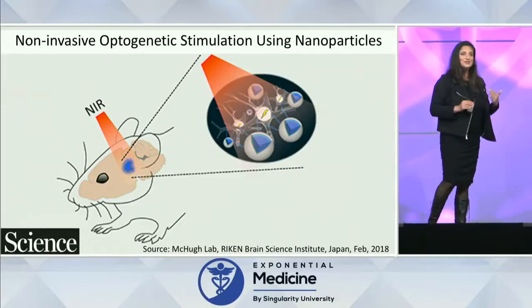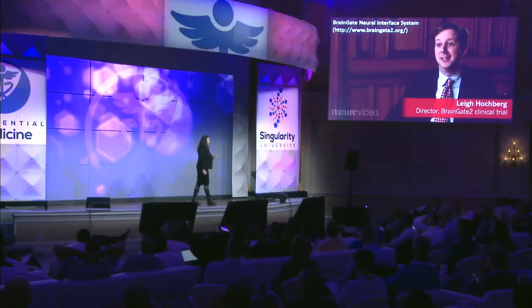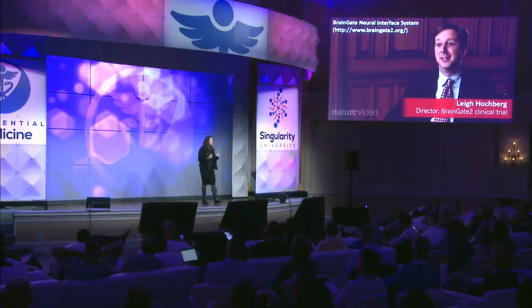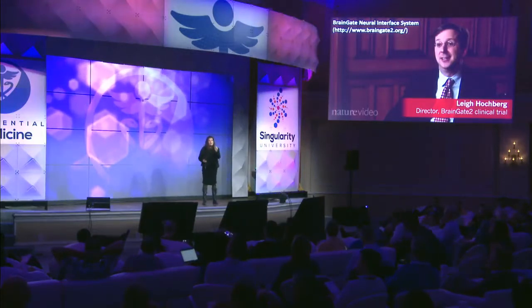Now, the holy grail has always been to use these devices to create brain-machine interfaces. Now, Lee Hochberg was with us a few years ago, and he actually founded the BrainGate Consortium. And if any of you have time, it's actually really worth looking to see what they've done. But essentially, they have a grid of microelectrodes that sits on the motor cortex of patients. And these are patients who are paralyzed. Many of them are quadriplegic, so they've basically lost sensation and motor function from the neck down. But they can think just fine. They can make planning movements just fine.